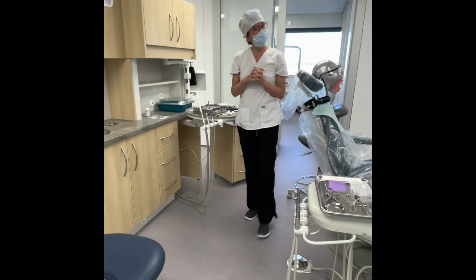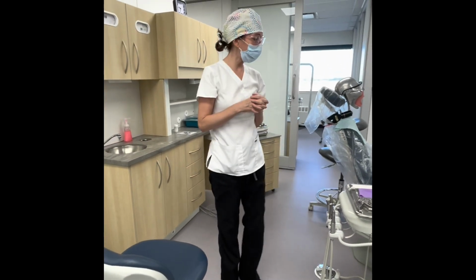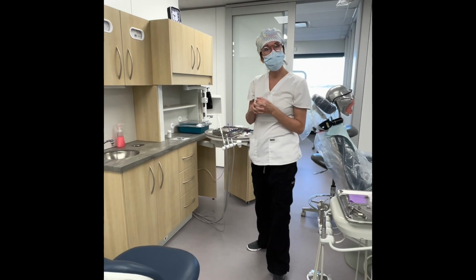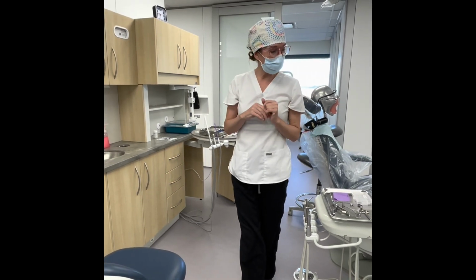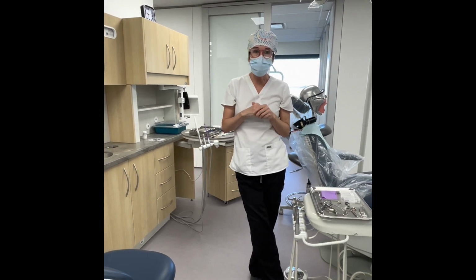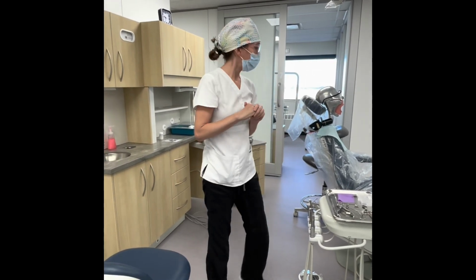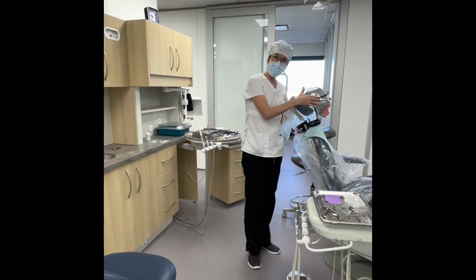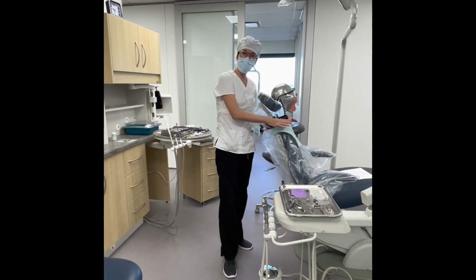Okay, so I've done my setup. I've asked the operator what burrs she would like in her hand pieces, and I've asked her what shades of composite she would like out. So that's all complete, my setup is done. Now what I'm going to do is retrieve my patient, okay? So I have the patient in the chair. I'm going to ensure that safety glasses are on the patient, and I've put a bib on them as well.